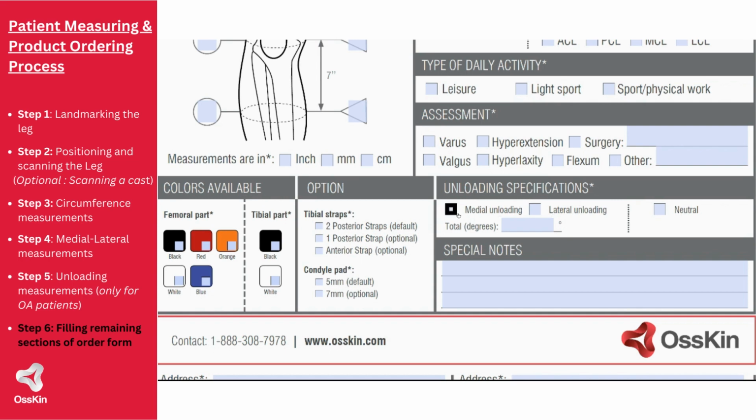So do you want the brace to be a medial unloader or a lateral unloader? And how many degrees of medial or lateral unloading specifically do you want for the patient? If you choose to have a neutral brace that will just give ML and AP stability, you tick here neutral, and in the total degrees, you will ask for 0.